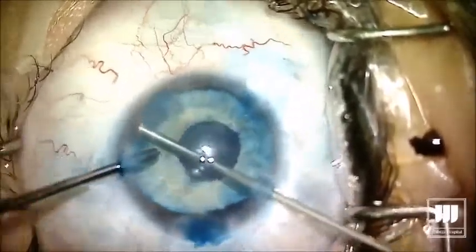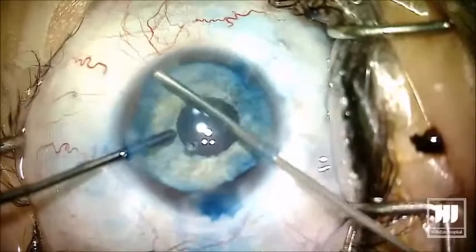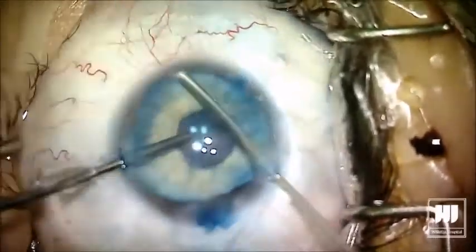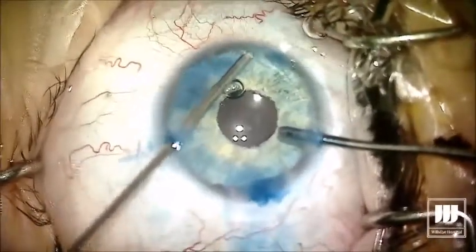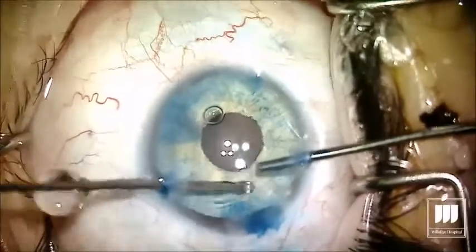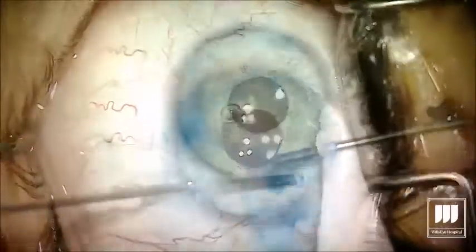Now at the end of the case — and I learned this during the FDA study, though this patient is post-FDA approval — if you leave some large iris remnants, they'll actually cast a shadow on the iris prosthesis. So in this case we're going to use the vitrector and just trim back the natural iris so that the prosthesis color shines through.